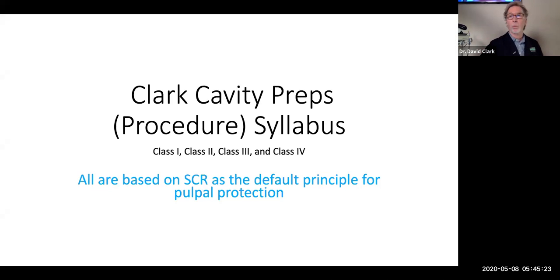All right. So I'm going to steal a couple of teeth from the Clark cavity preps, the Class 1, Class 2, Class 3, Class 4. This was a lecture that we gave yesterday for the school. So we're going to pull a couple of these standardized preps out, but these are based on selective caries retention. That's the lexicon that we've settled on. Selective caries retention. You could also call it selective caries removal, but really, more purposefully, selective caries retention. We don't want to be ashamed of the fact that we're letting the tooth heal the carious dentin naturally by providing a great restorative seal.